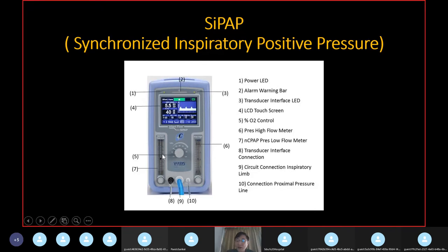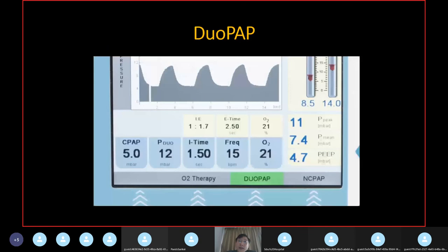So that's why it is used in a neonate, because with the limitation of the inspiratory flow, it is much safer. You do not go to very high inspiratory flow that can cause a pneumothorax in a neonate, right? As compared to the V60, one has to be very careful, especially when we try to use the V60 NIV in a small infant or even in a neonate. Although sometimes we do it in a neonate or a small infant, it is not recommended by the factory.